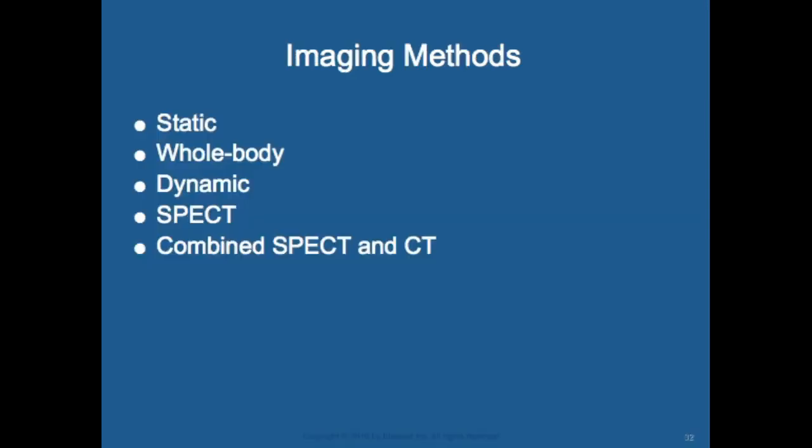Okay, imaging methods. So there's static, whole body, dynamic, SPECT, and combo SPECT and CT.